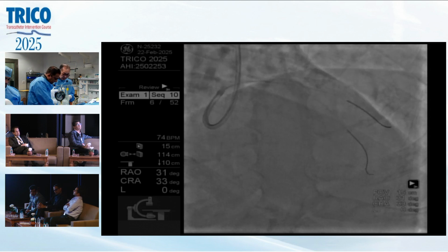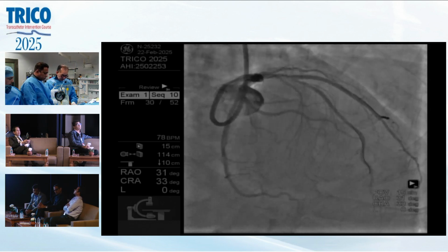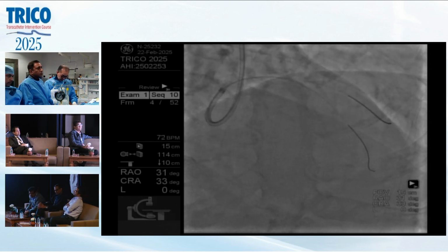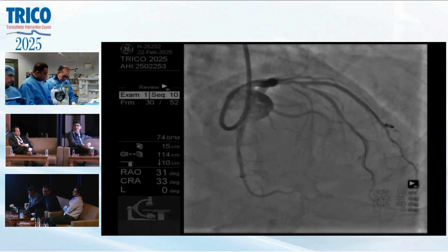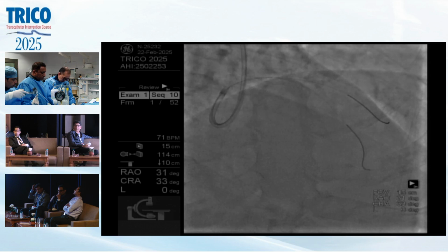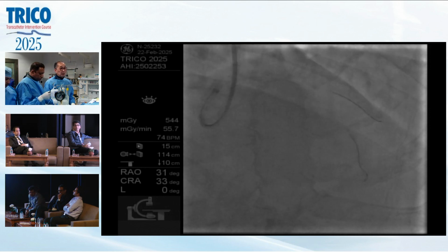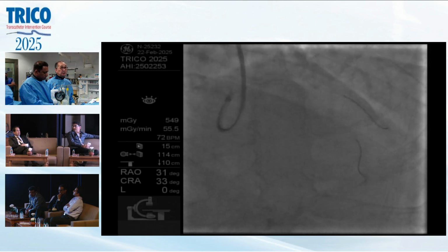The 2.75 stent is a very similar platform. What do you think? You like the Science stent? You can expand better. Not about expansion, but about the plaque shift and creating more problems for the side branch. Oh, this one I don't have any particular preference. So which one do you think has less plaque shift?